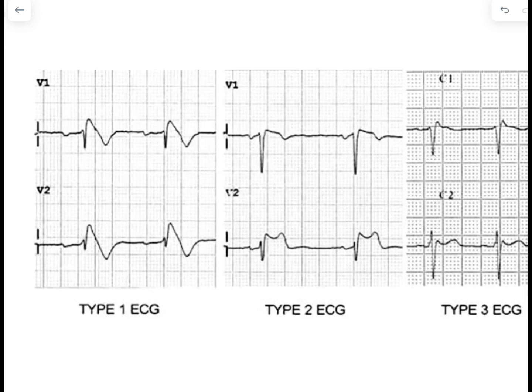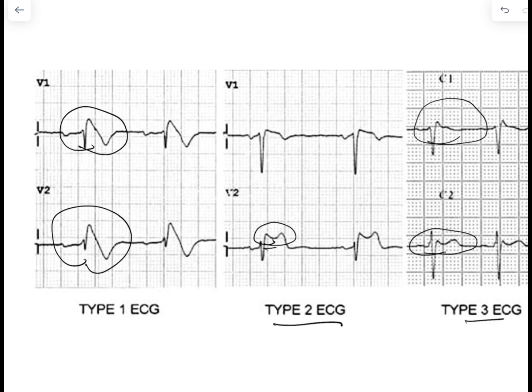Let's have a look at the other two ECG patterns previously termed Brugada type 2 and type 3, which are no longer used. In the type 2 pattern, there is ST elevation of at least 2 mm in any 2 of V1 to V3, but the shape of the ST elevation is a saddle shape — not coved upward as in type 1. Type 3 is ST elevation of less than 2 mm. Both type 2 and type 3 are no longer considered Brugada patterns; they are of historical significance only.